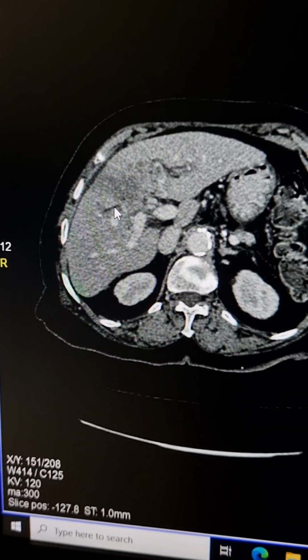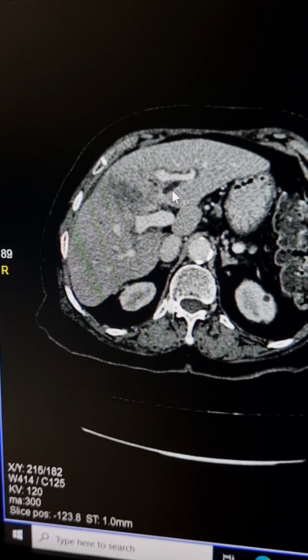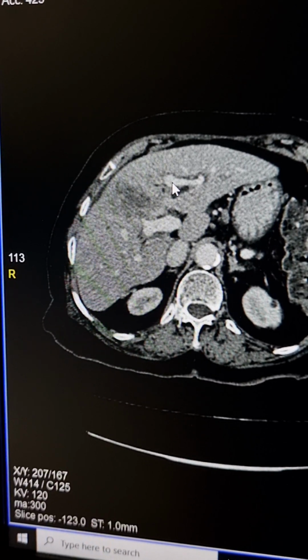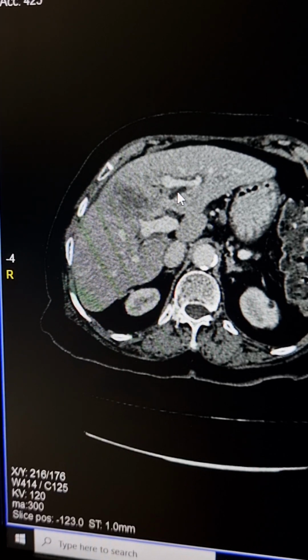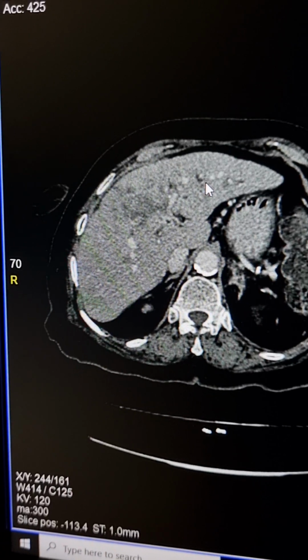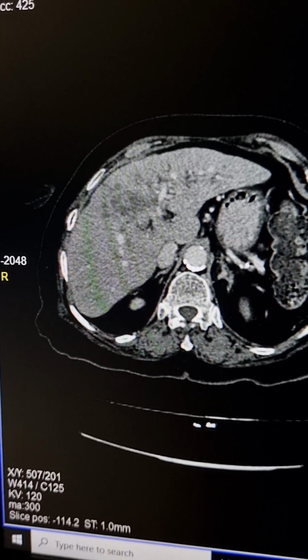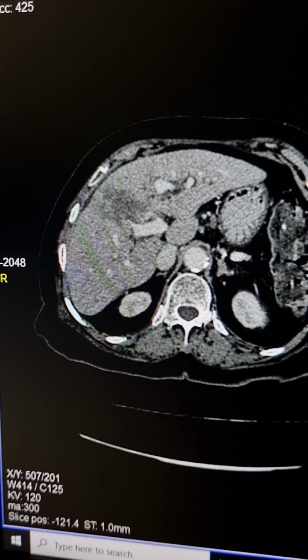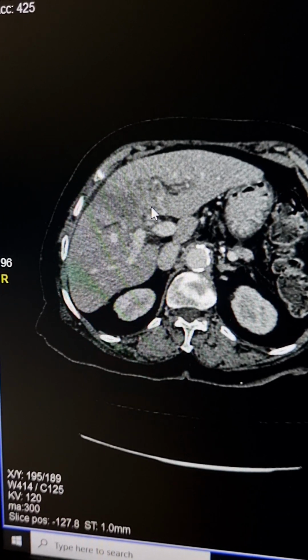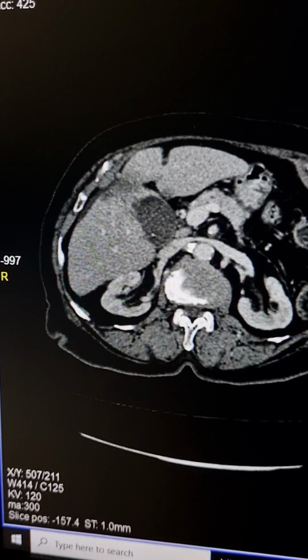The patient had raised alkaline phosphatase levels. Now these are the dilated intrahepatic biliary channels. These are the opacified intrahepatic branches of the portal vein, while these, which are not opacified, which are black, are the intrahepatic branches of the dilated biliary channels. So the patient had blockage or obstruction at the level of the right and the left hepatic ducts. We trace it downwards. The common bile duct is of normal caliber.